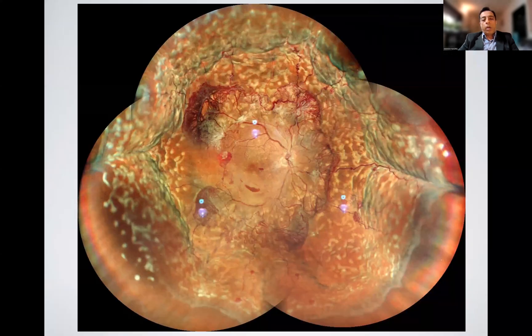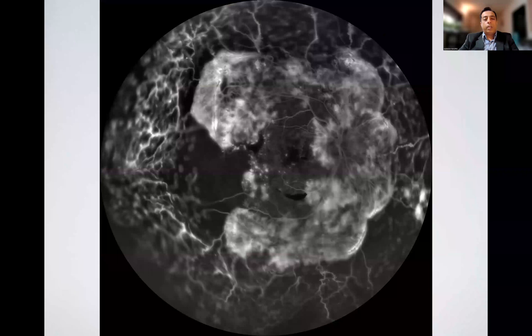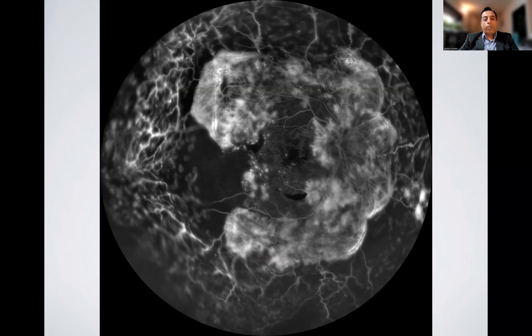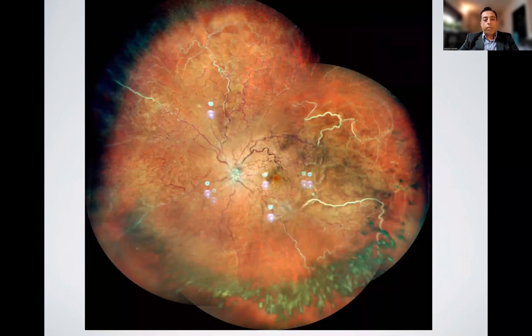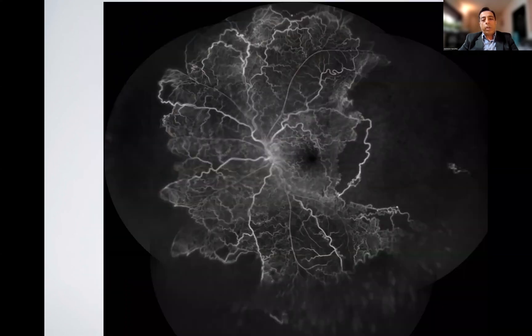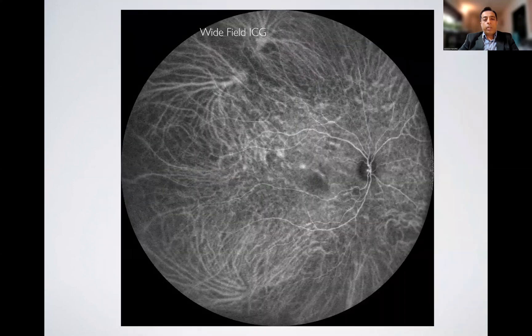This is a patient who underwent extensive PRP and had come to us for a second opinion. You can see a freshly lasered diabetic retinopathy who formed choroidals. Look at the whole wide-field image, all 360 degrees with the choroidals and the recently done laser. When you do an angiography you can appreciate the wide-field view. A patient with extensive peripheral CNP areas and sclerosed vessels — you can appreciate the FA showing very well-demarcated CNP areas using the Mirante.